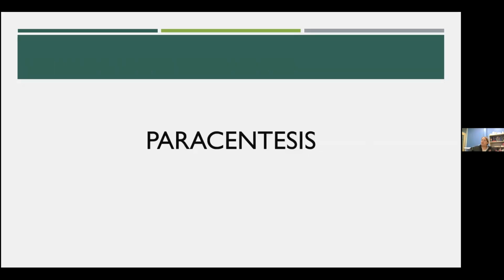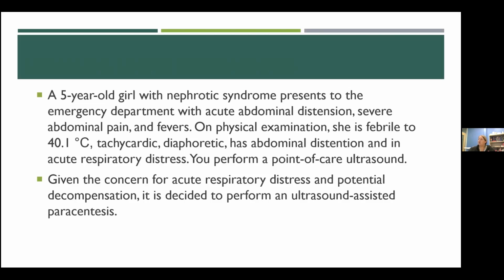Moving on to paracentesis. This is a very similar procedure to me as thoracentesis, right? You're using a needle and or a catheter to get fluid out of a potential space that's now filled with fluid. So here we're going to flip to a new patient.